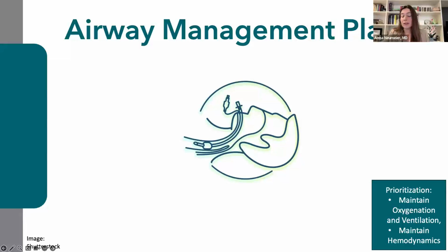If at any point bag valve mask ventilation cannot be performed, an emergent surgical airway should be obtained. If bag valve mask ventilation is anticipated to never be successful, for example, due to an upper airway compromise, then awake intubation should be performed. By pre-specifying the number of attempts for each technique, you will prevent injury to the airway and you will have your equipment ready for each subsequent approach to ensure you have the greatest chance of success.